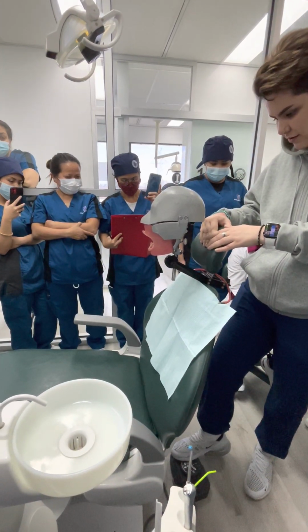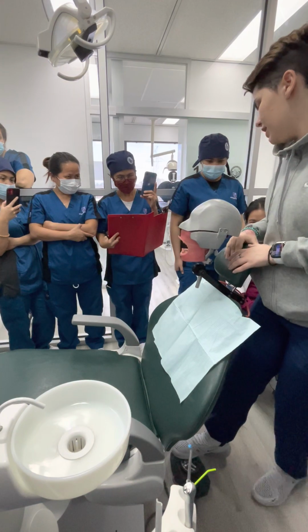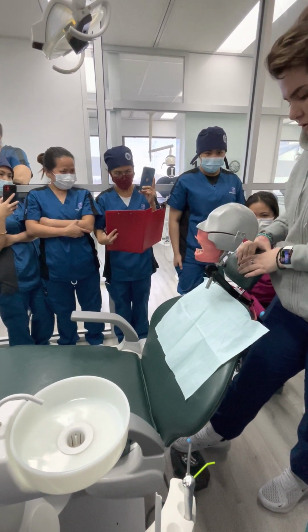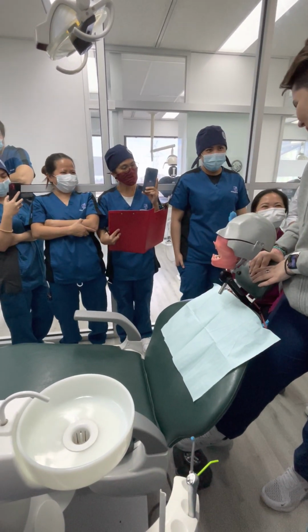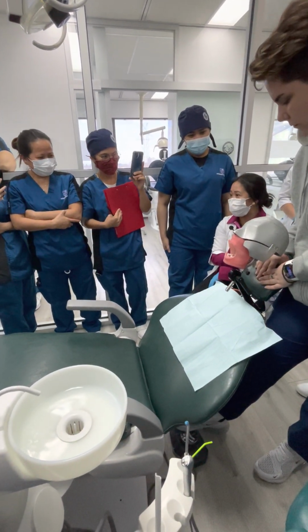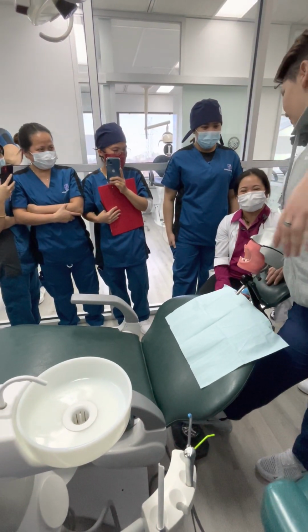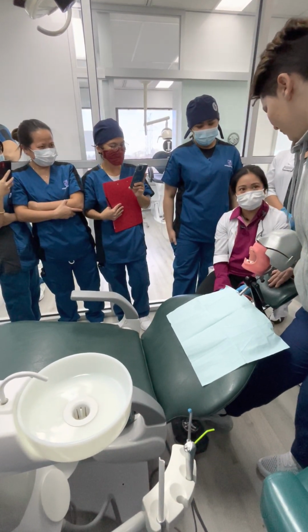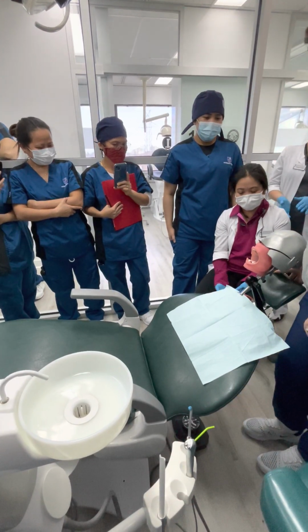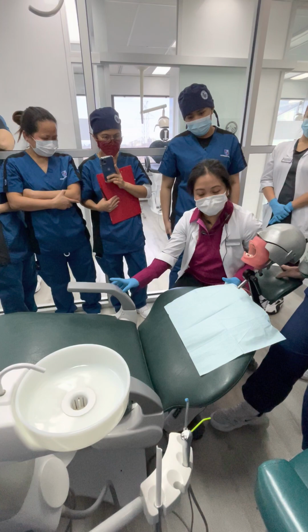I'm going to make it as low as I can. So the chair should be at least at elbow level of the operator. The operator's knees is short. You have to put the chair up first. Is this enough for you? Up first. So that's not supine.